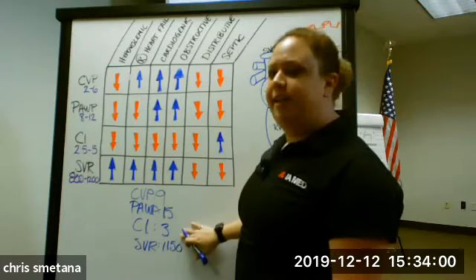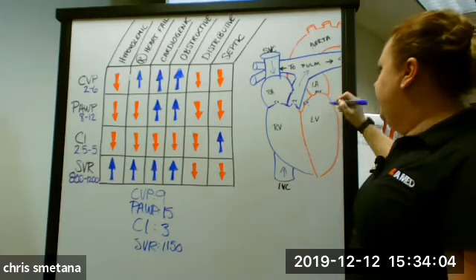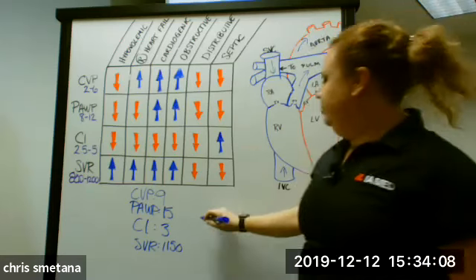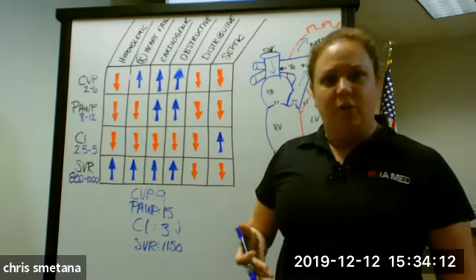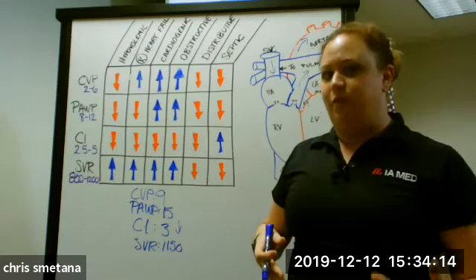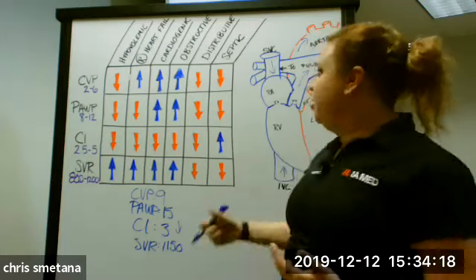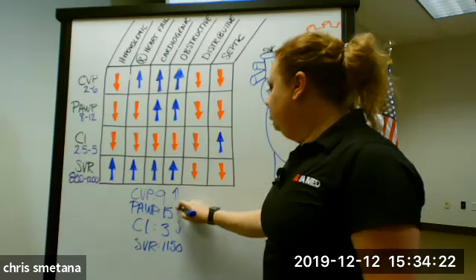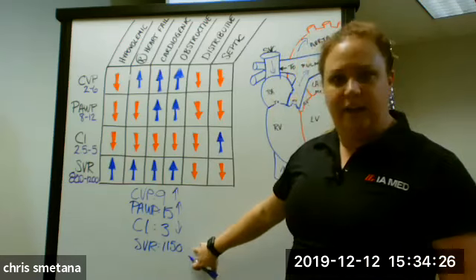I look at my cardiac index. My cardiac index, meaning the blood flow leaving out here of my left ventricle into my aorta, it's at 3. It's not super low, but it's still on the lower side of normal. So I'm still moving blood. My left ventricle is still so far functioning, but overall, not super happy with my cardiac index. And my SVR, I'm hanging out at 1150.